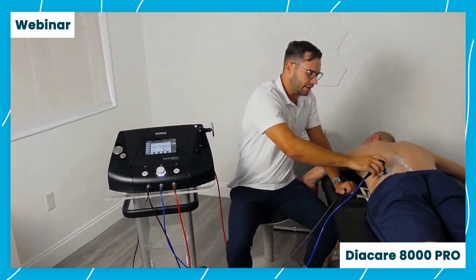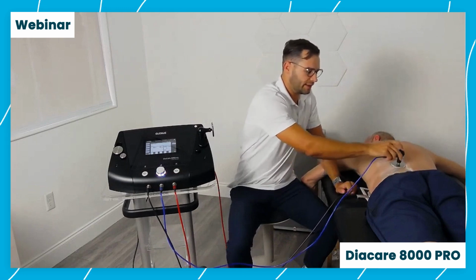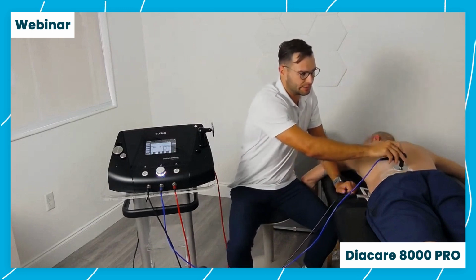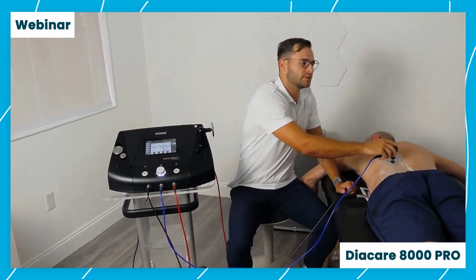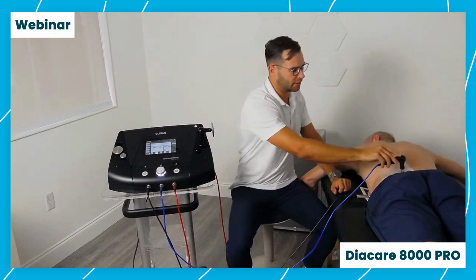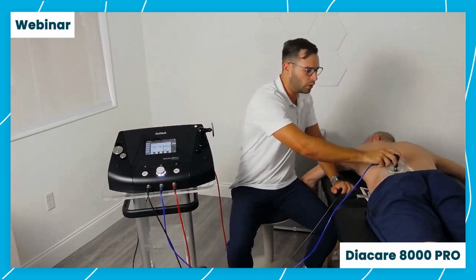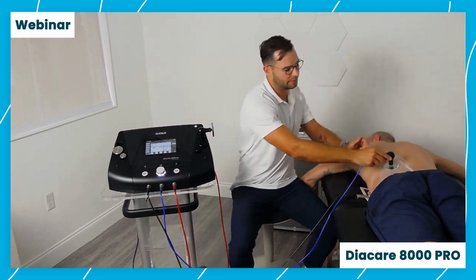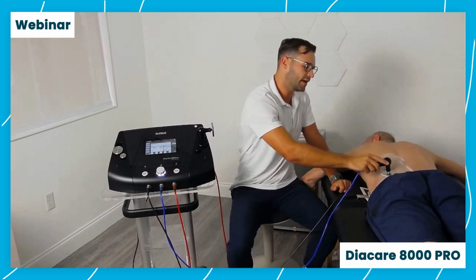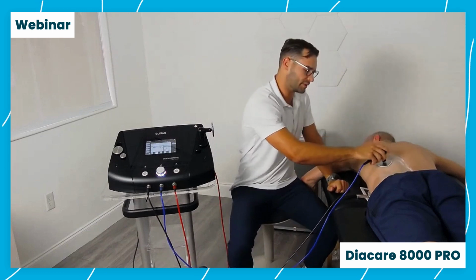So with the Diacare 8000 Pro, there are lots of different ways to generate the energy and to use it throughout the body. We have, of course, our normal mode, where we're using the return plate, but we can also use a mobile return plate. It's a very similar attachment to this, and you can actually be holding it on the patient and having them move and go through exercises.